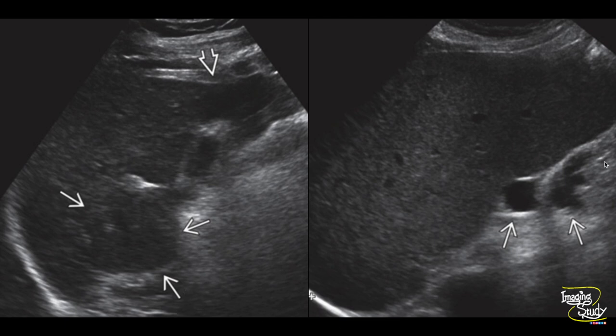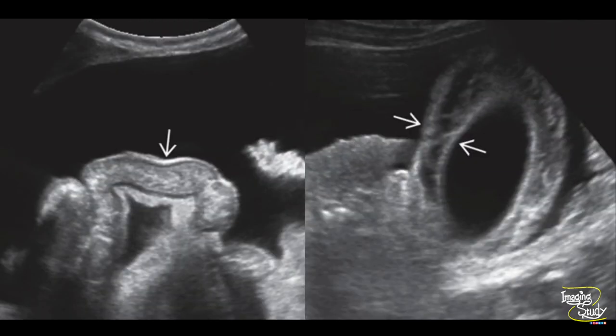This oblique transabdominal ultrasound in the same patient shows splenomegaly with dilated tortuous veins at the splenic hilum indicating splenic varices. You can see a huge amount of ascites here with a bowel loop showing mural edema due to portal hypertension or hypoalbuminemia. You can also see the gallbladder wall is thickened and edematous due to hypoalbuminemia or poor venous drainage.